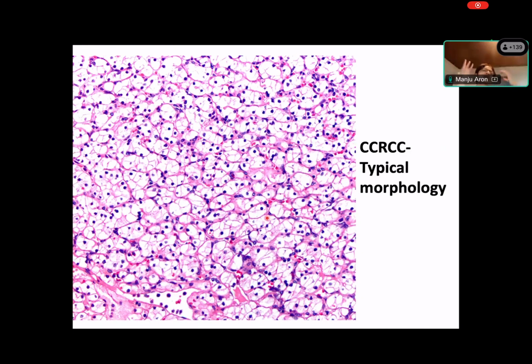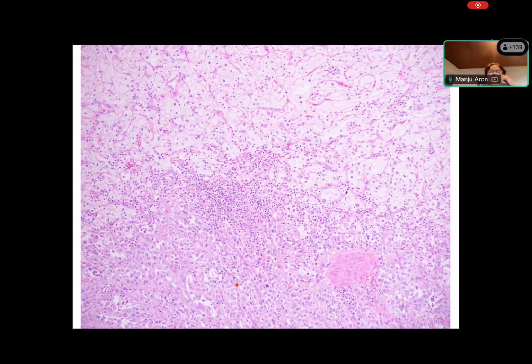This morphology, I just wanted to imprint it in your mind, is the typical morphology of clear cell RCC. In any tumor which shows this, I don't care how other areas look, this is definitely a case of clear cell RCC. Here, again, this is just to show you necrosis, which has to be differentiated from infarction. In necrosis, you will see the pyknotic nuclear debris, which you don't see in infarction. This is important because it's an independent prognostic parameter for clear cell RCC.